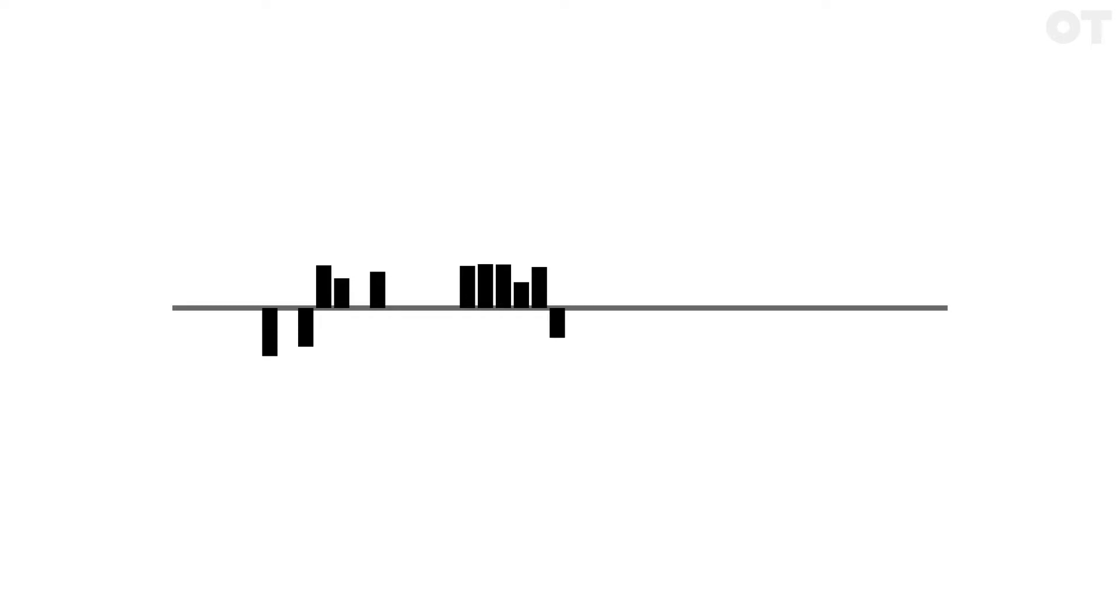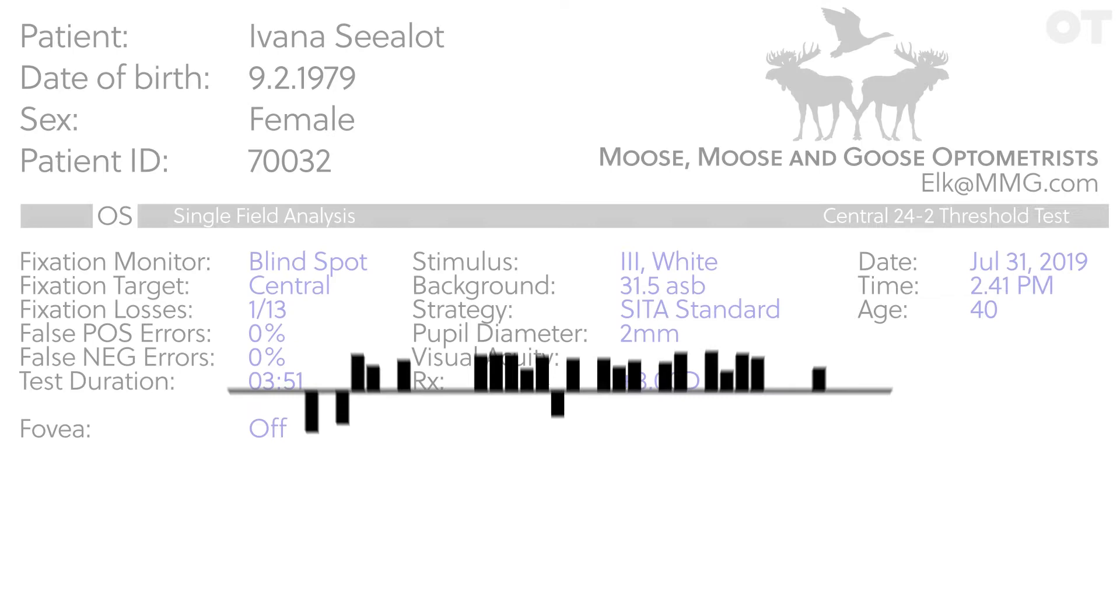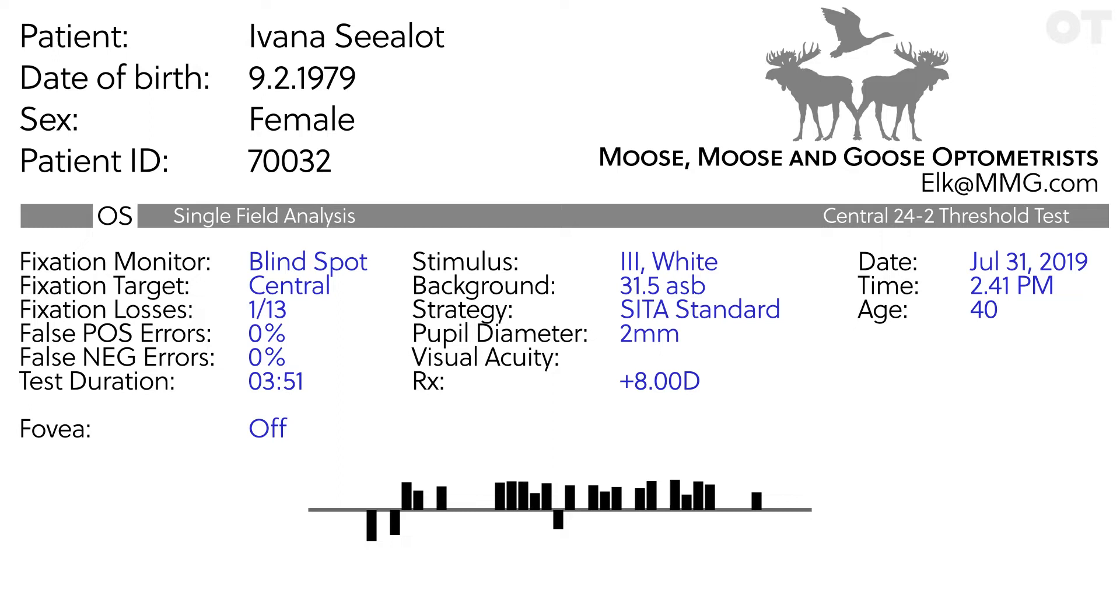Upstrokes indicate fixation loss at the time a stimulus was presented and downstrokes indicate a blink or that the eyelid prevented gaze tracking, for example in ptosis. Greater than 20% fixation loss rate may suggest compromised results but does it concur with the gaze tracking record or is this artifactual? For example, the patient's head tilted or the machine couldn't find the blind spot.